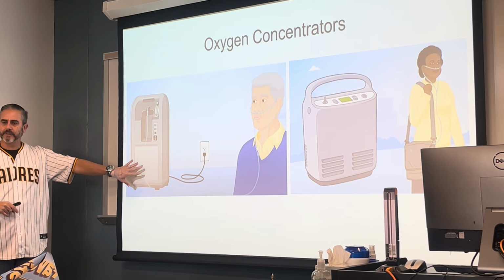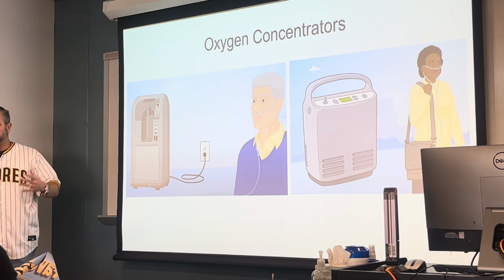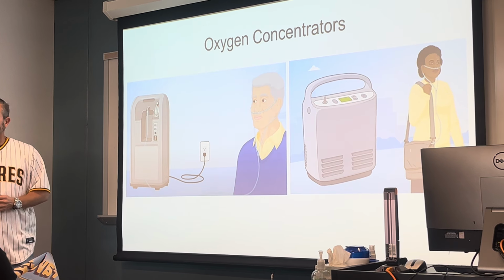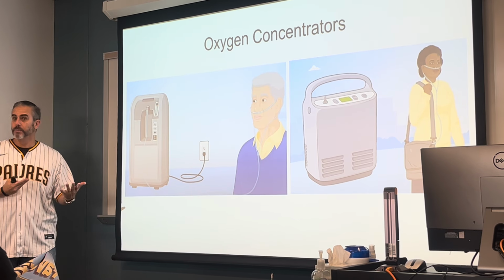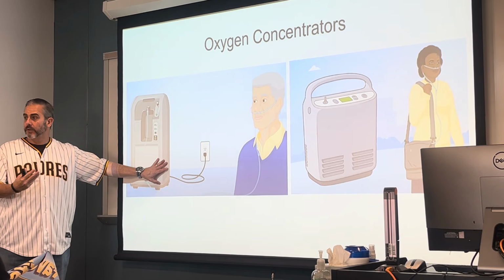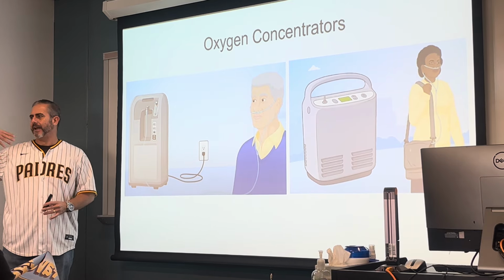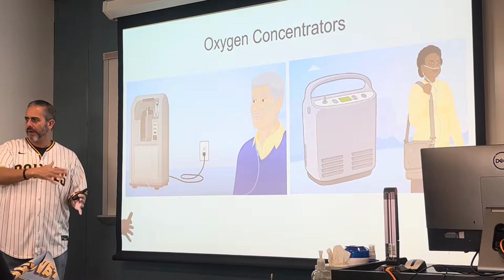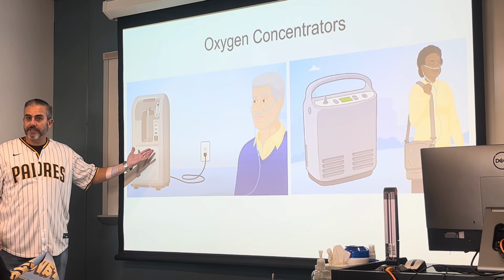Another thing to note with something like this, again, what powers this? Electricity. We've been blessed this hurricane season with no delays or anything like that, but living in Florida, when a storm's approaching, and if my loved one, if my patient has one of these, and a storm comes by, or even gets close, or even an afternoon thunderstorm, where certain parts of town sometimes end up losing power more frequently than other parts of town. You know, what happens if the power goes out?